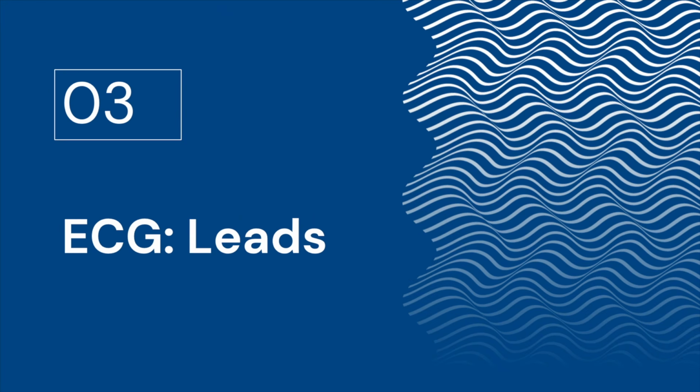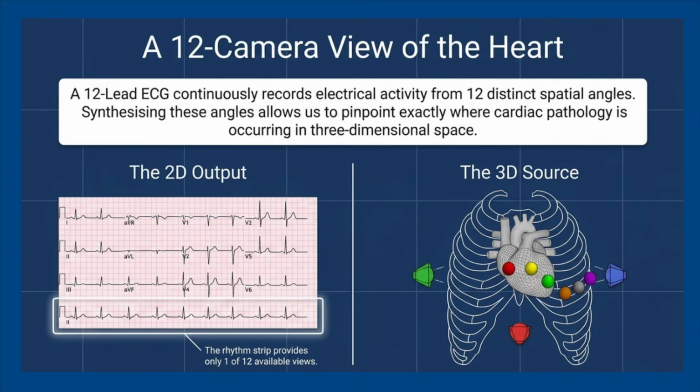Before interpreting abnormal cardiac rhythm, axis, ischemia, or different types of arrhythmias, we must first understand what the leads actually represent and how the ECG views the heart. Standard ECG uses 10 electrodes to generate 12 views or camera angles of the heart. A useful analogy is to think of the ECG as placing 12 cameras around the heart.